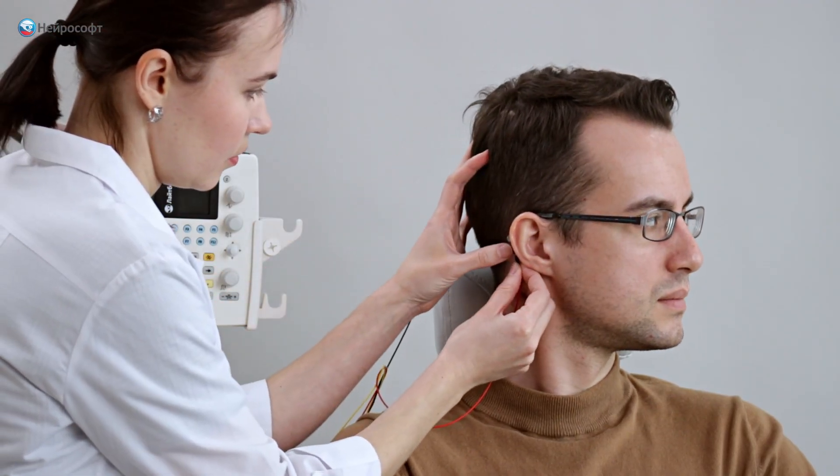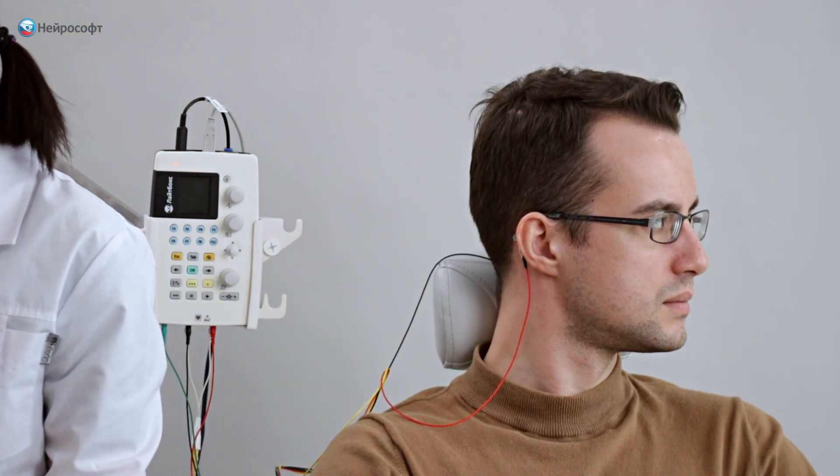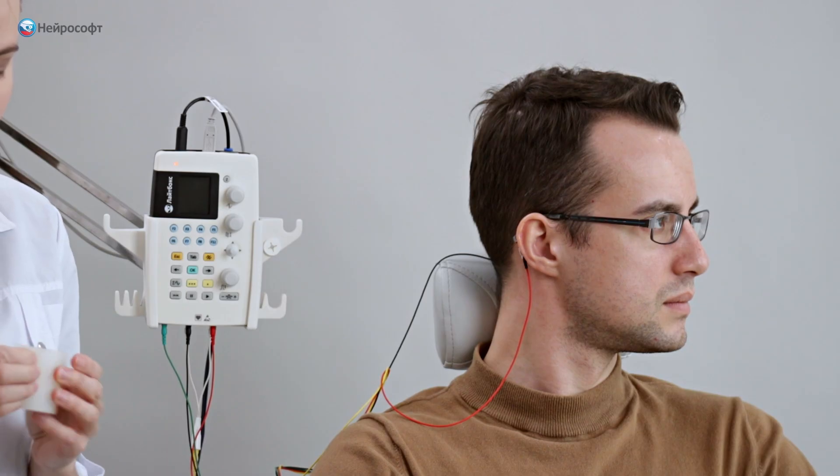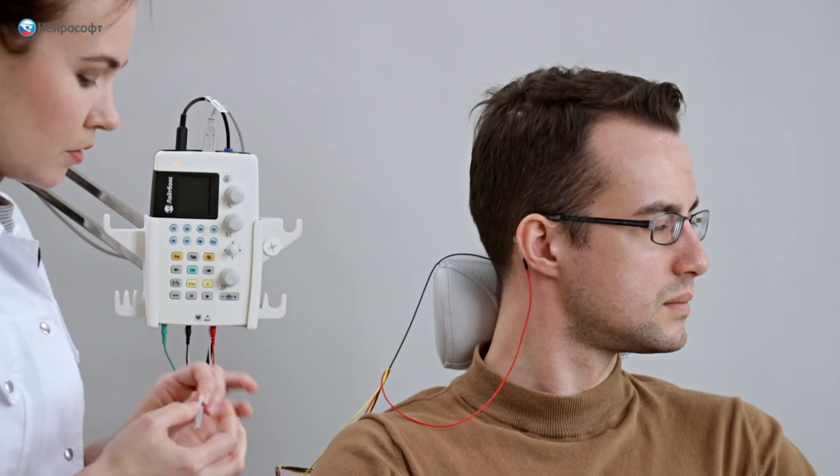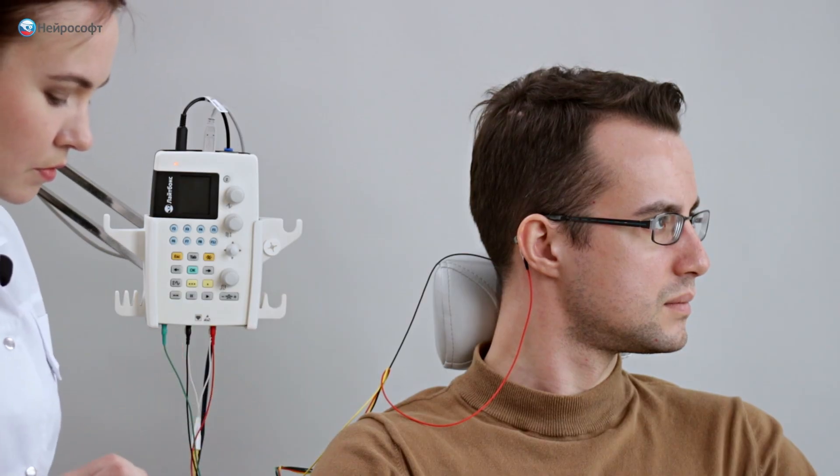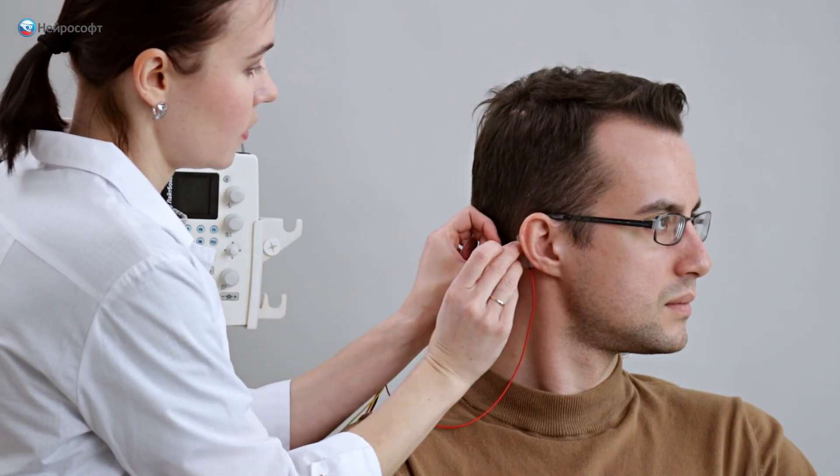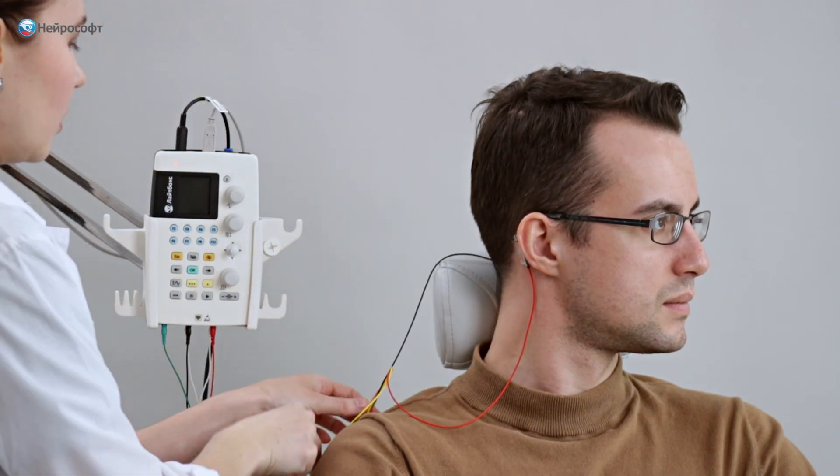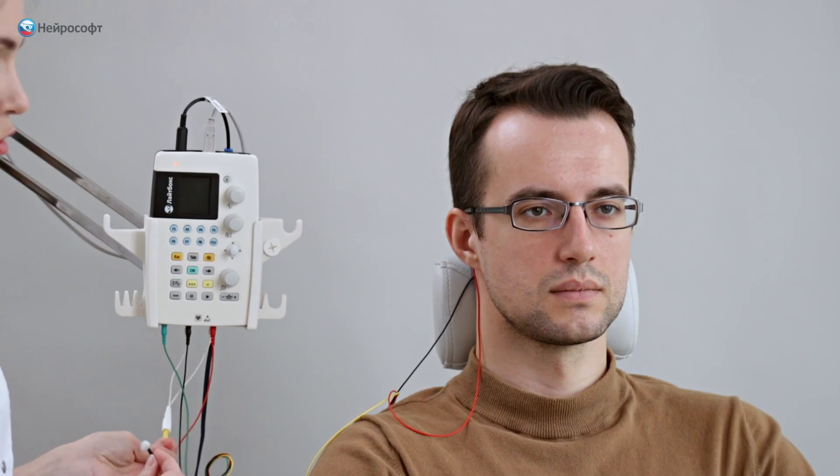Similarly, fix the active electrode on the right mastoid. The reference electrode will be located in the vertex area. Since it is one for two active electrodes, when connecting it to the amplifier, we use a combiner.